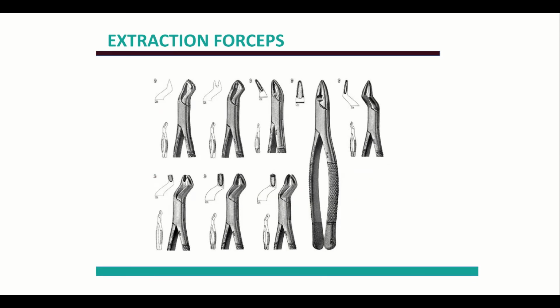And then of course the forceps themselves that are going to be used to pull the tooth out. Notice here, and there's a few slides coming up next about forceps and how important the tip is and the angle of the tip. So you can see in this case there's a little off-kilter angle there. And then this one's shaped fairly straight. This one is totally straight up and down. This one has a bend in it right there. So they're shaped specific for the type of tooth that you're extracting, and you'll learn which one goes with which, and we're going to go over all that in class.